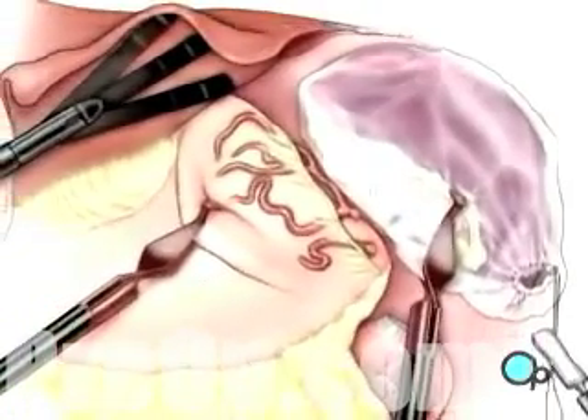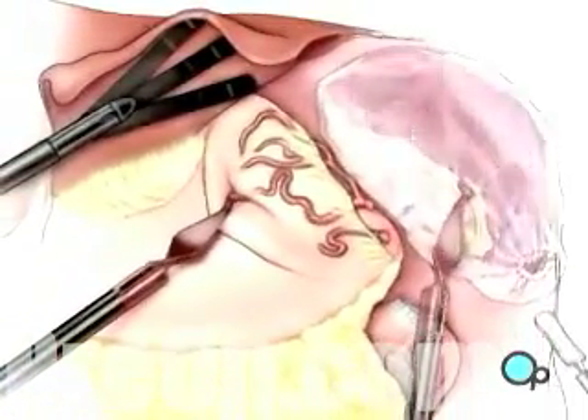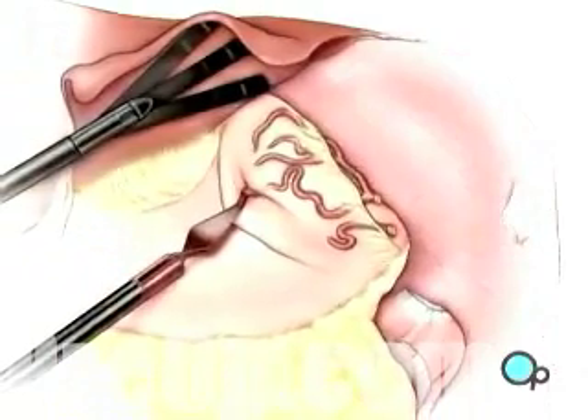Finally, the spleen is maneuvered into a special retrieval bag, where it is broken into smaller pieces, and removed through one of the laparoscopic working ports.